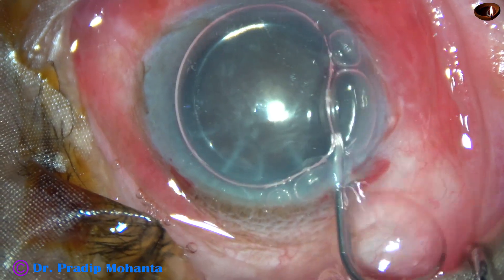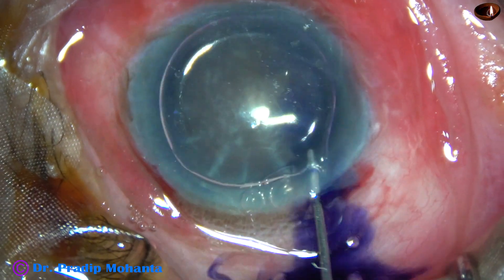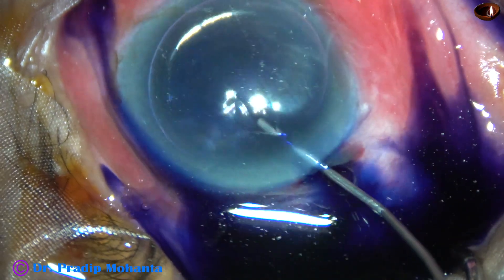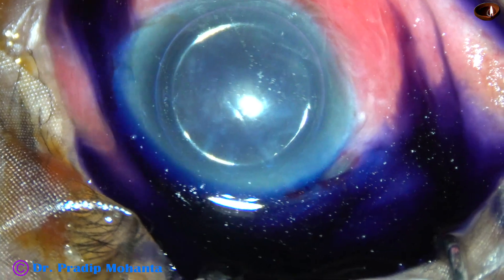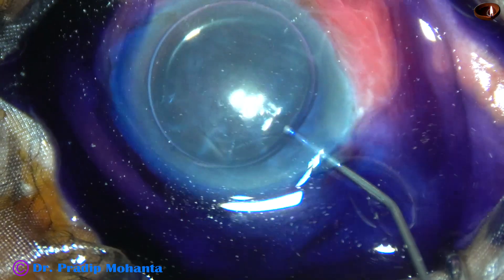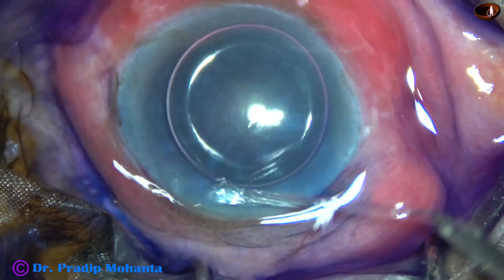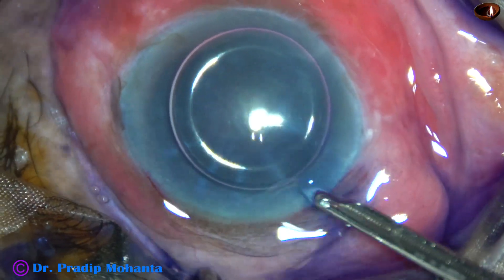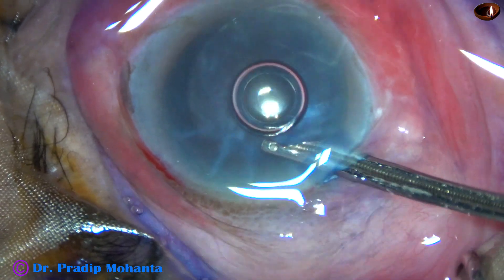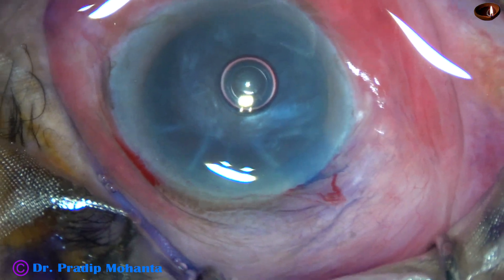In this case I have made only one side port. Now an air bubble is injected in the anterior chamber and then trypan blue dye is applied over the anterior capsule beneath this large air bubble. Since there is no red glow, this stain will give enough contrast to do the rhexis very well, very comfortably. Now the dye is washed out. This is a real-time video, no editing at all, so you are watching each and every step of the surgery.